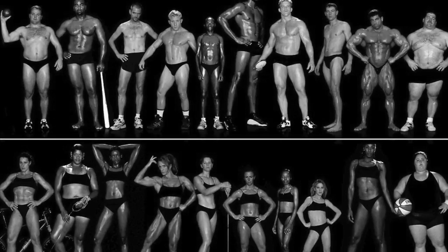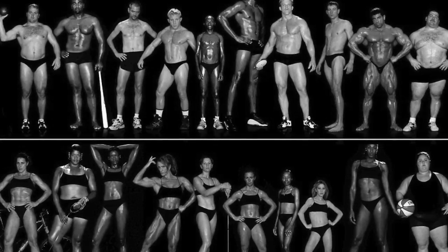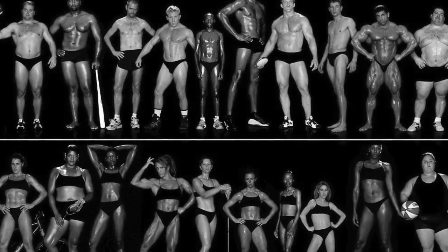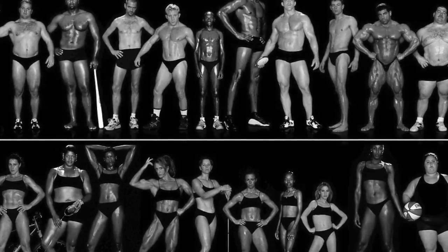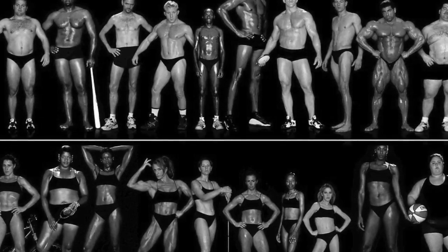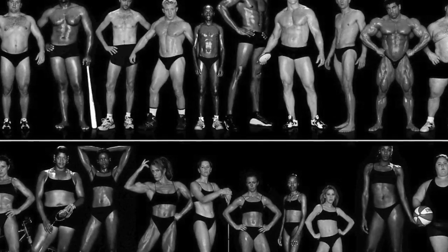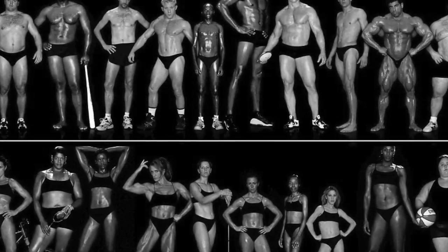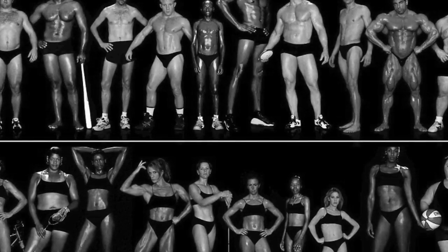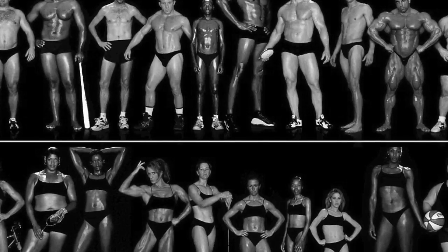The fixed kV chart benchmarks the technique settings needed for various body sizes. The use of calipers allows the technologist to choose the appropriate technique based on the measurement of the part of interest. The calipers are positioned to measure the thickness of the body part based on the direction in which the central ray is projected. We are now going to view a short video emphasizing both improper and proper techniques and some of the possible outcomes.